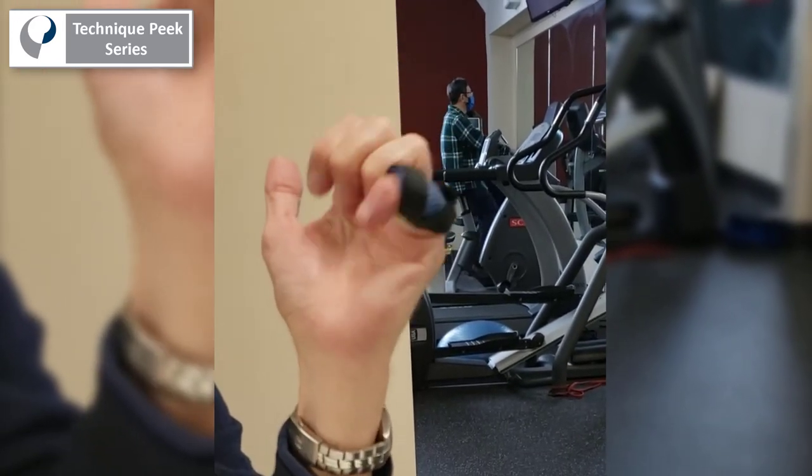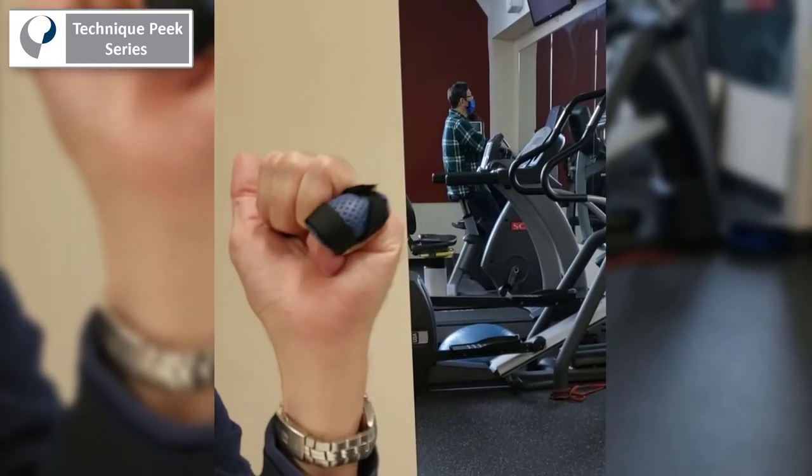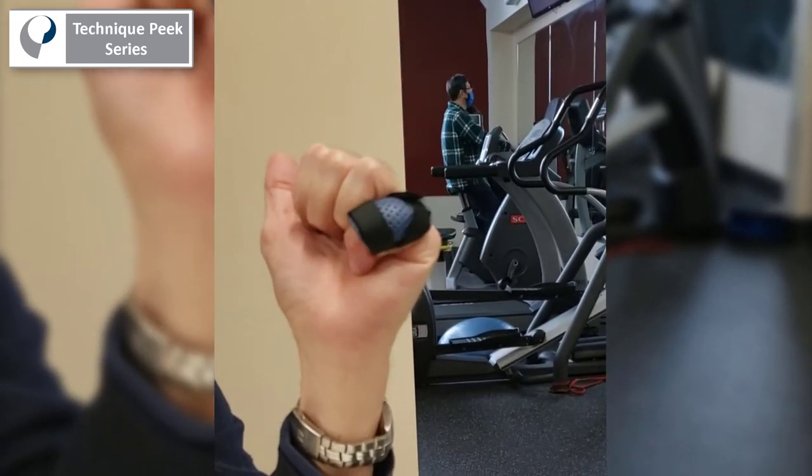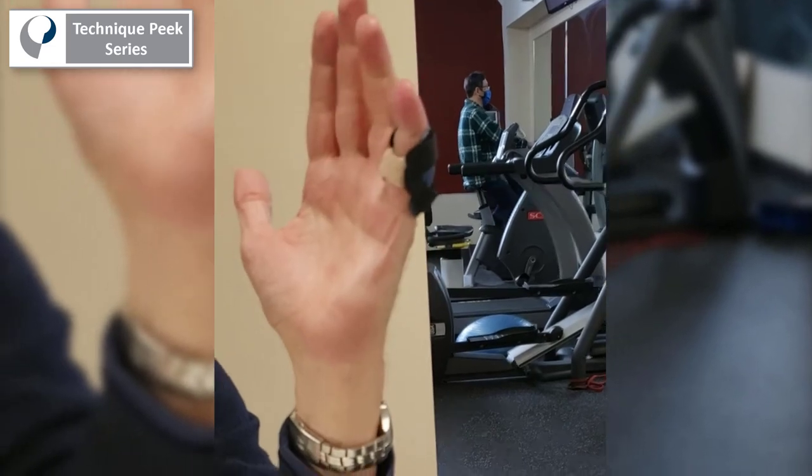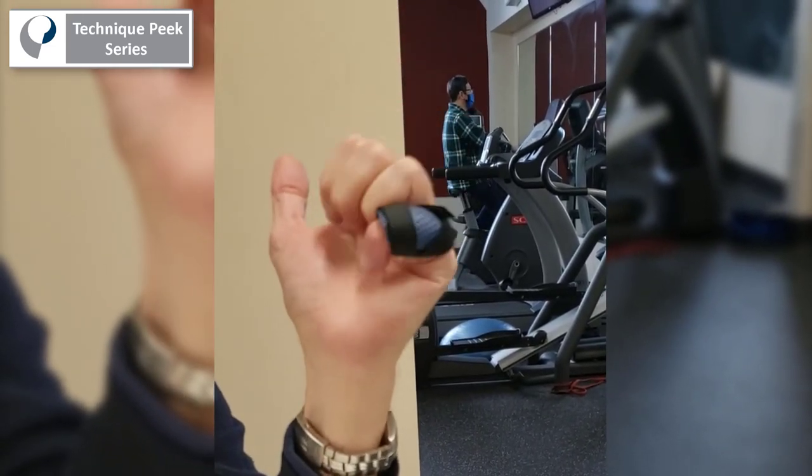While donning that splint, you can see that he is able to actively make a full fist and extend to the limit of the blocking splint with no difficulty, allowing him to have full functional use of his hand despite the swan neck deformity.